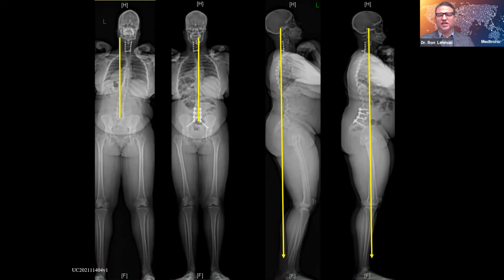And so many surgeons will say, well, yeah, that's great, Dr. Lehman, but you just did a 2-level surgery. It's not really a deformity operation. But I would actually probably reword that and say this really is a deformity operation, because by doing a good job of realigning the spine, really in the sagittal plane, you can see now her legs are completely straight, her knees are straight, she's not extending her hips, her gravity line in terms of her skull goes right through her femoral heads, right through her knees, and hopefully this lady now ends up not with a much larger surgery to help correct this.